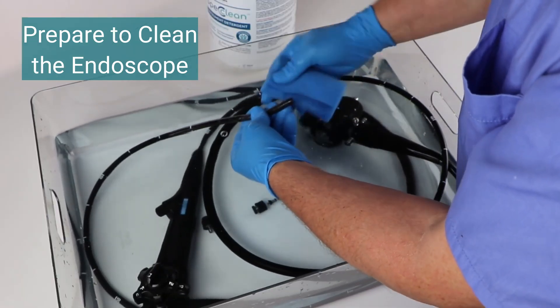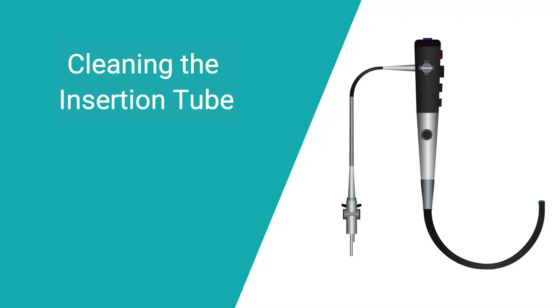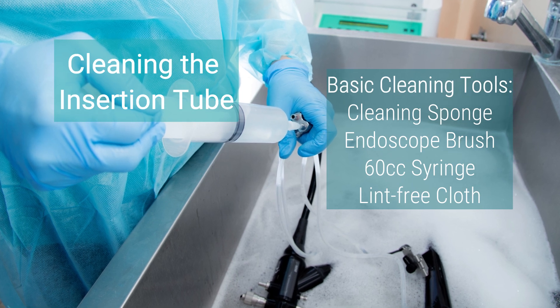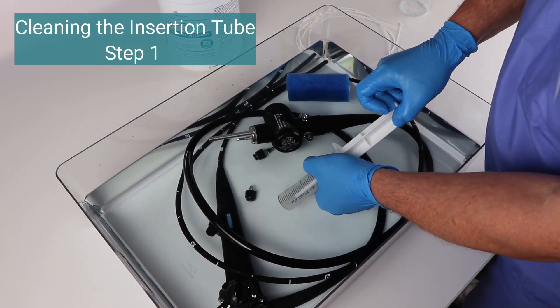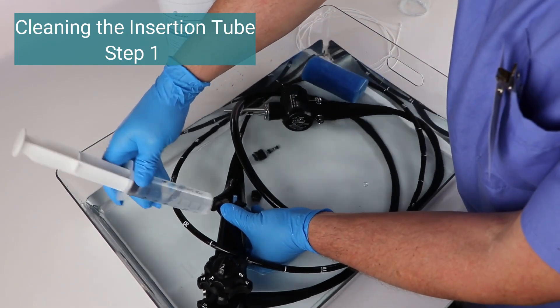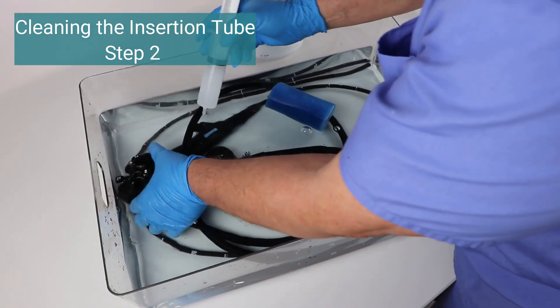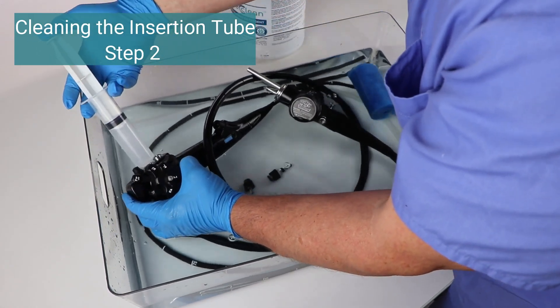Use an endoscope sponge to wipe clean the outside and end tips of the endoscope. Most endoscopes can be manually cleaned using basic tools, including a cleaning sponge, an endoscope brush, a 60 cc syringe, and a lint-free cloth. Step 1: Suction up the enzymatic cleaning fluid into the syringe and push it through the biopsy instrument port until the fluid comes out of the distal tip. Repeat 1 to 2 times. Step 2: Repeat the process by pushing cleaning fluid through the suction port. The endoscope channels are now filled with cleaning solution.